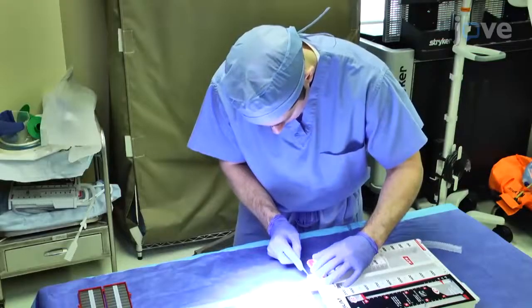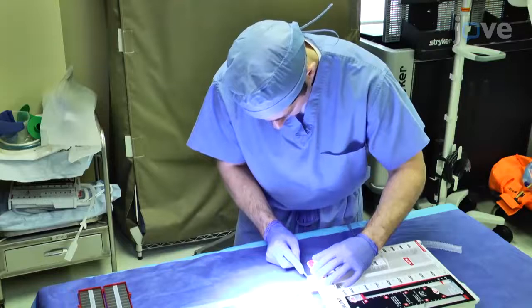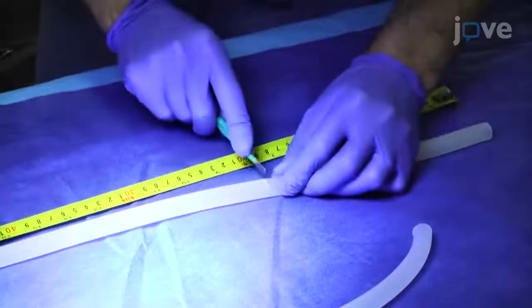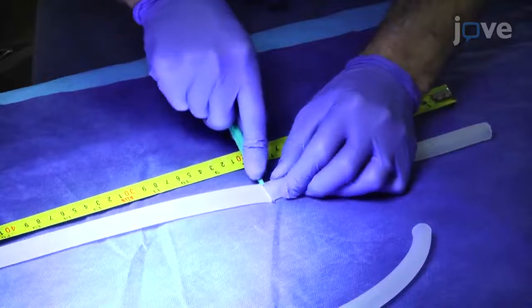To simulate a vessel and subsequent vessel injury, cut one piece of rubber tubing from a water seal chest drain for the vena cava and one for the descending aorta.